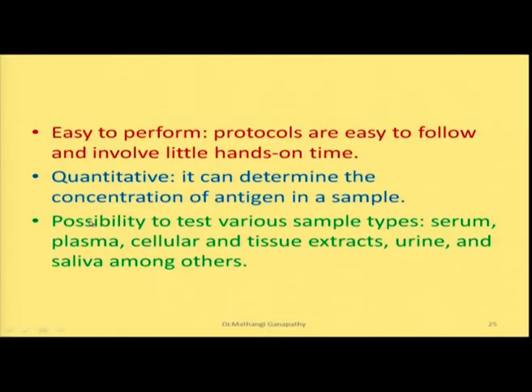It is quantitative. It can determine the concentration of the antigen, especially if you are using a fluorogenic or chromogenic substrate, since the intensity of the color or the intensity of the fluorescence will tell you the concentration of the antigen which is present in the sample. And it is possible to test various sample types. You can test serum, plasma, cellular tissue extracts, urine and saliva.